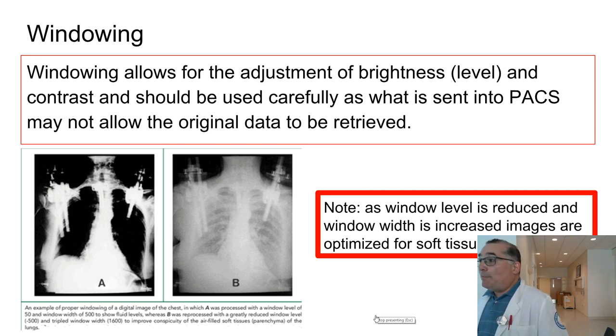especially after a certain amount of time goes by. In our lab, I'm not worried about our plate reader running out of memory. But in a regular hospital, what they do in 2 weeks, we probably don't do in a year of actual exposures. Maybe even a week, right? Where they're taking hundreds of exposures. That being said, memory is not infinite. So occasionally you start to lose information, right?